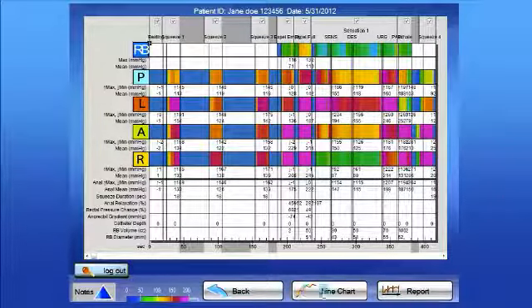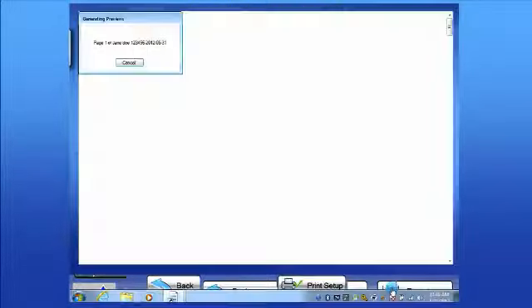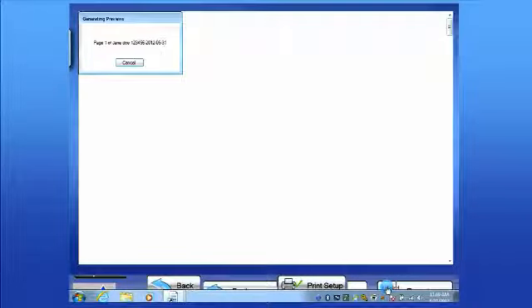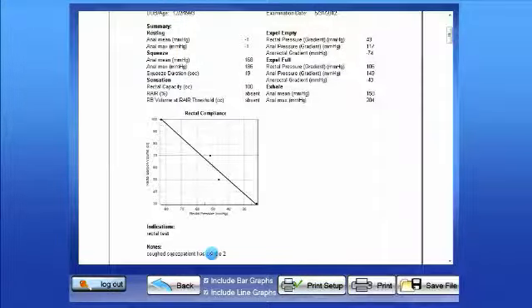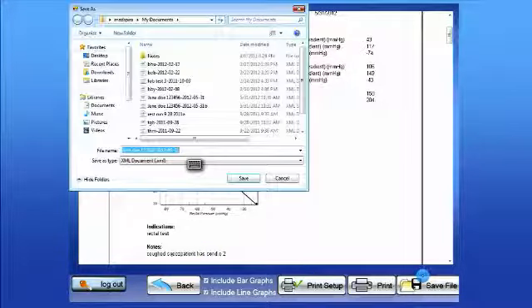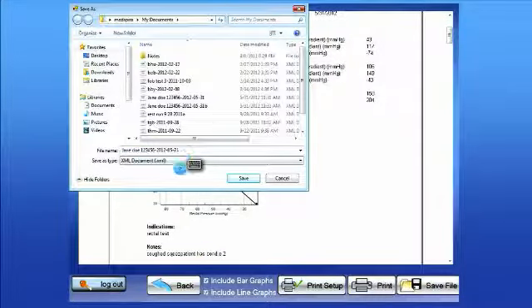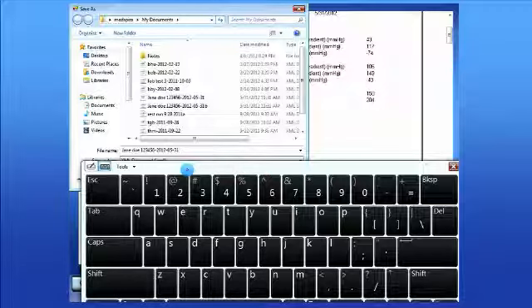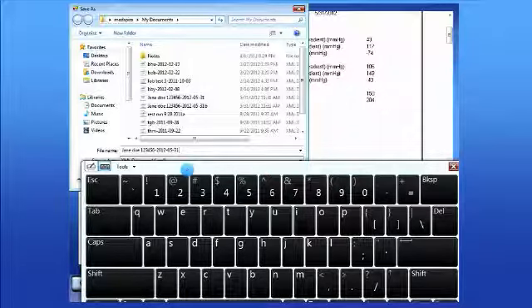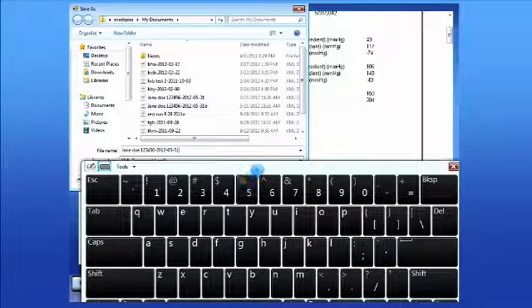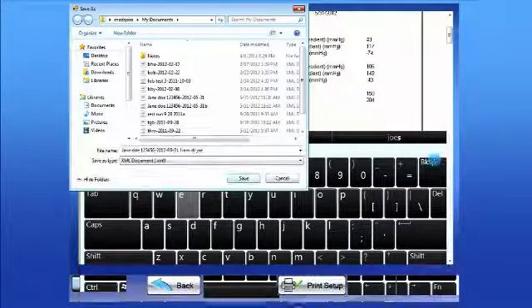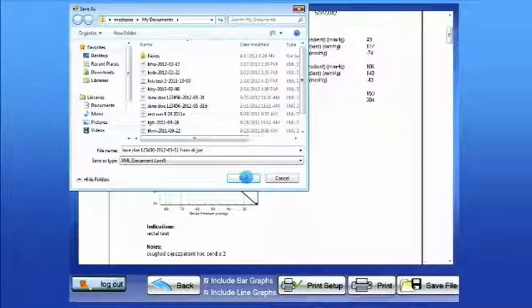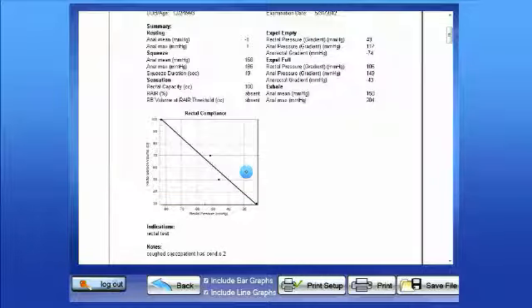Now when you view the report, you'll see that your notes will appear at the bottom of the screen in the notes section. If you choose to save that file, use an appropriate naming for the file, such as with the individual's name who's added the comments. Now it's a completely separate file with the new interpretation notes on the bottom.